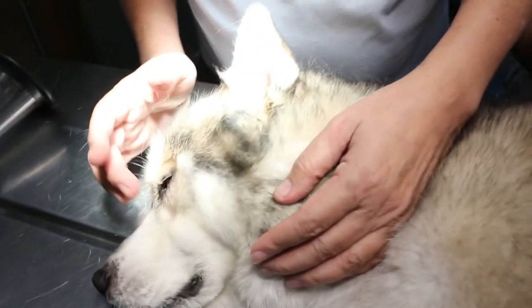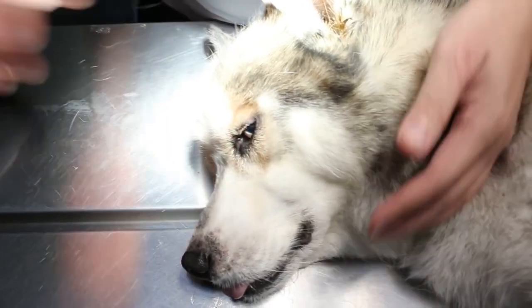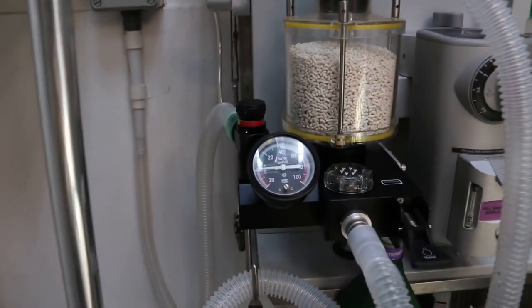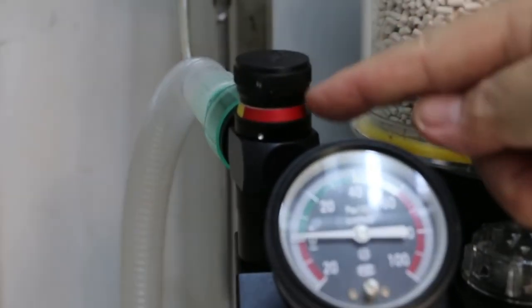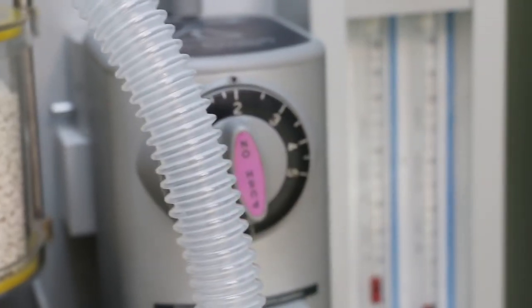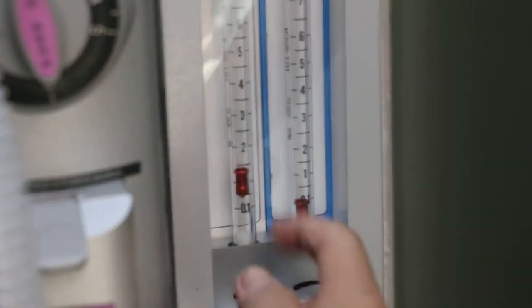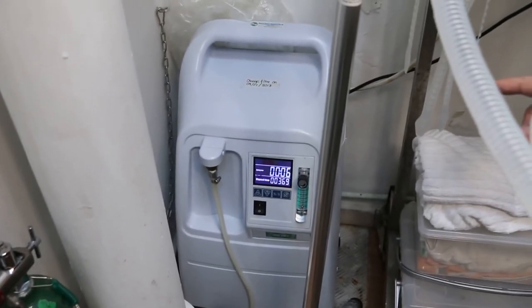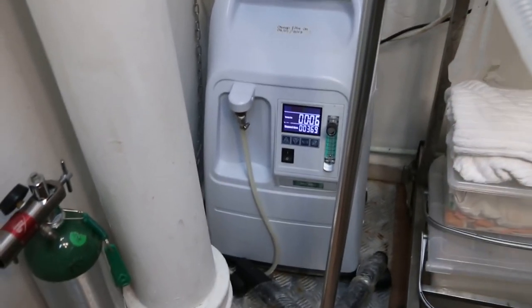The dog is not really 100% down, so we will top up with isoflurane gas on closed circuit — the red dial is closed circuit. I put it at 2% as the maintenance or top-up dose, with oxygen flow rate about 1 litre per minute. There is also an oxygen generator that generates oxygen from air, rather than a cylinder.